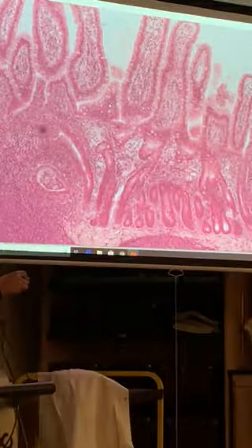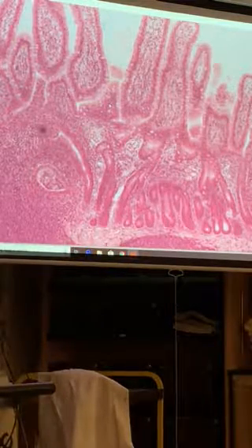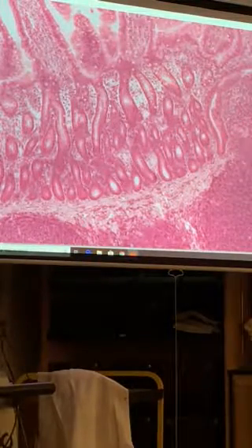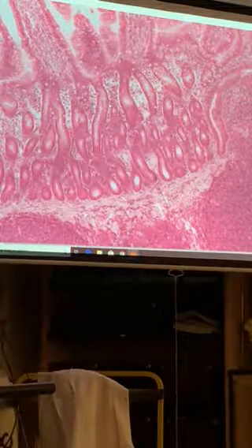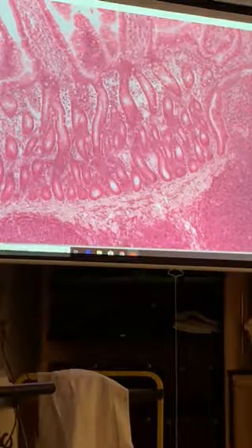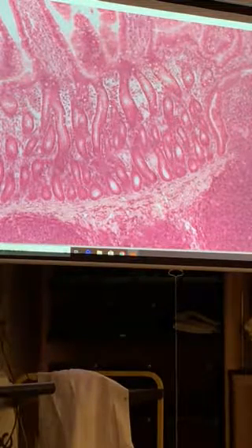And what does it look like? It looks like epithelium with a little white oval in the middle. So those are mucosa layer. It's only in the mucosa. These are all the intestinal crypts. Go to the base of the mucosa. Usually you don't point to them up high. It should be the base, the little pocket in between the villi. So here, here, here, here, here, all these guys.